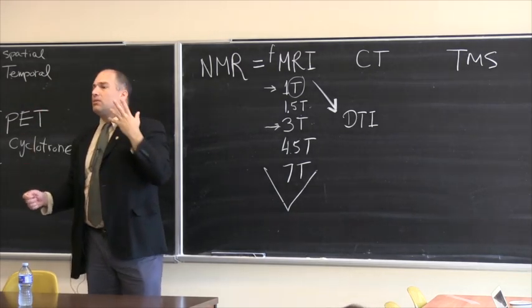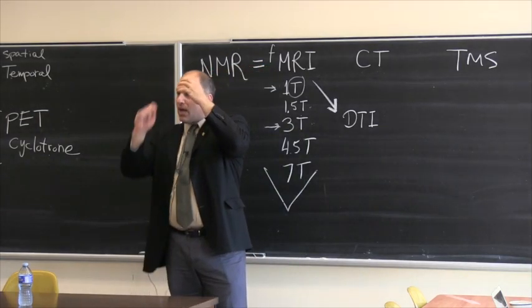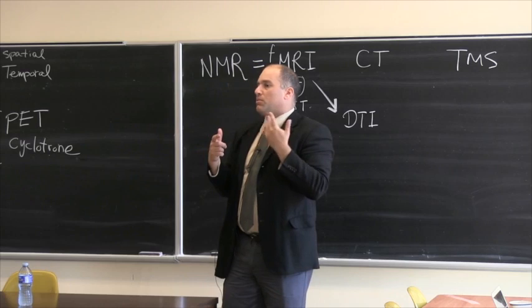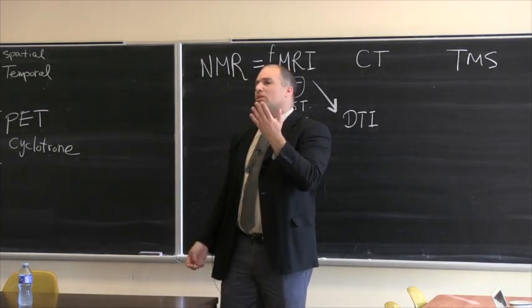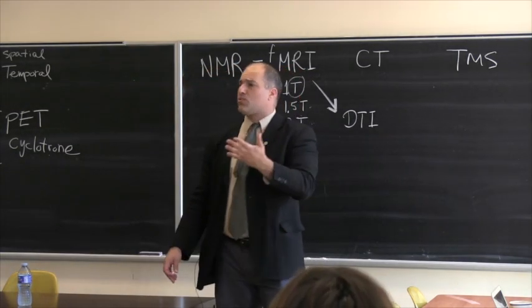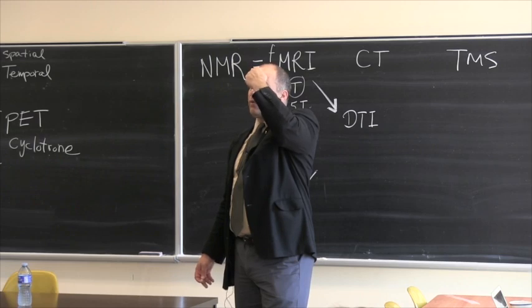Some of it is being swallowed, some of it is being deflected, and you're basically looking at the reflection of the light, how much has been absorbed, how much of it has been coming out. This is not something you can do with your bare eyes; you do it with very sensitive sensors, and allegedly, based on the light that has been absorbed, you can say something about the activity of the brain. This is a very crude method, but it works. It works if you're interested in information right here, behind your forehead.